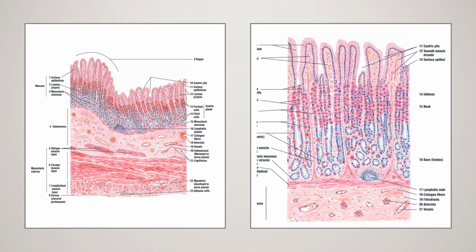Next, if you go down, you can make out the hematoxylin-stained chief cells. So if you see this beaded appearance with all the four layers of GIT, that is the fundus of the stomach. This is low power, in which you are going to see this. This is a high power. I projected this to demonstrate these parietal cells.